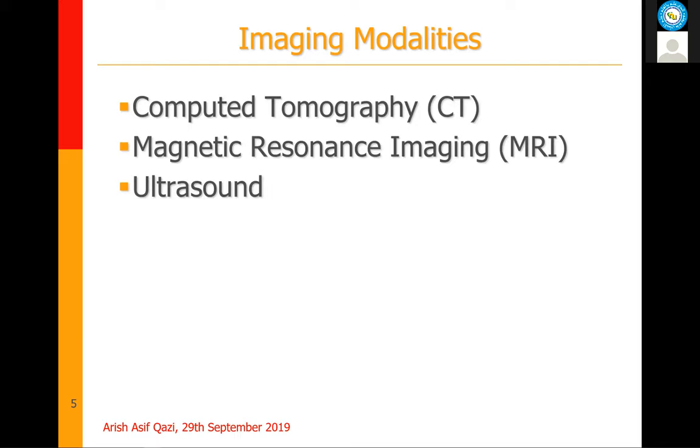Then we have ultrasound, which actually uses sound waves. It's a very common imaging technique, prominently for monitoring fetal growth. Then we have PET and SPECT. PET is positron emission tomography, and SPECT is single photon emission computed tomography. They're both based on the CT technique. However, they rely on a radioactive tracer being injected into the human body.